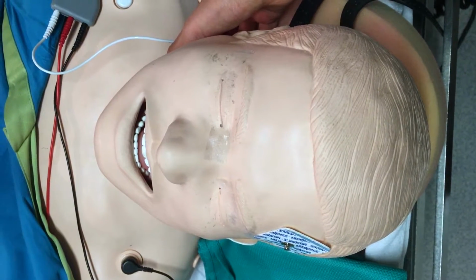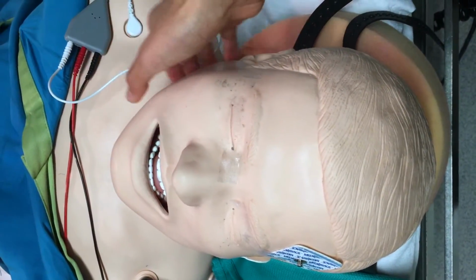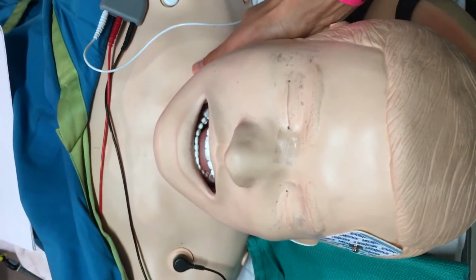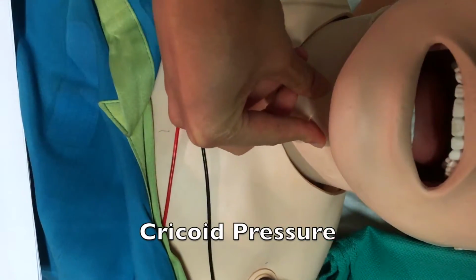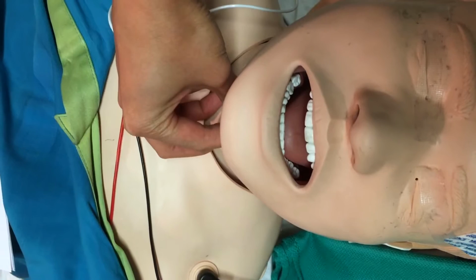There are external measures you can use to help when you intubate someone for a better view of the vocal cords. What you can do with your right hand is help extend the neck even more, placing it right here, or you can put cricoid pressure, push down, and that helps to bring this into a better view when you're doing direct laryngoscopy.